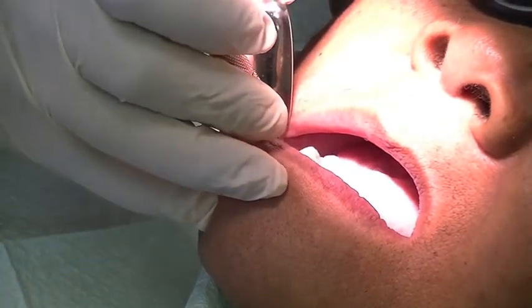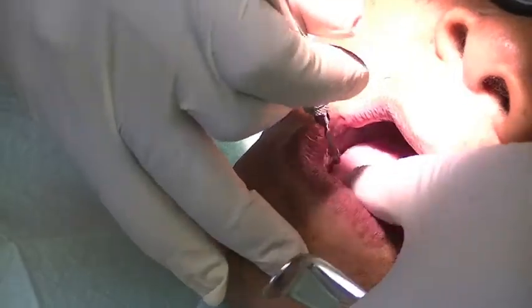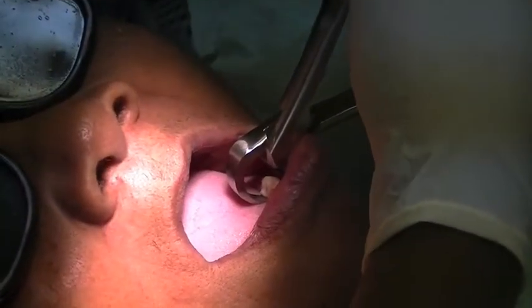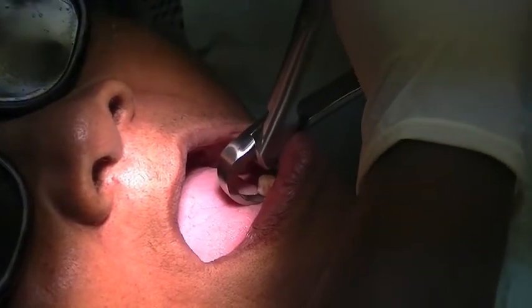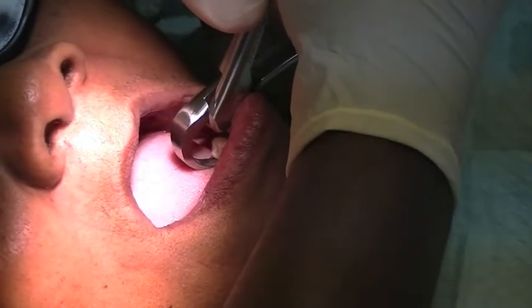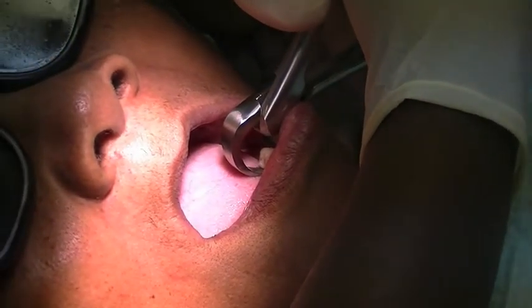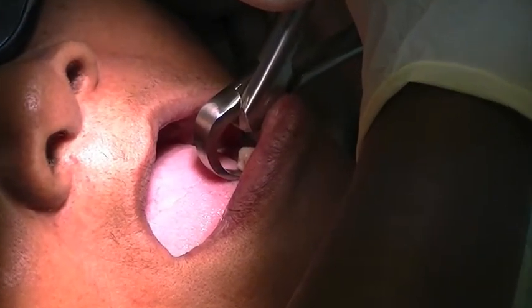A little sensitive there. Okay, I'll apply a little anesthetic in that area. To keep myself from clamping down on the forceps, I just use the insides of my outer fingers, just to grasp it. And we're going to just rotate the wrist.